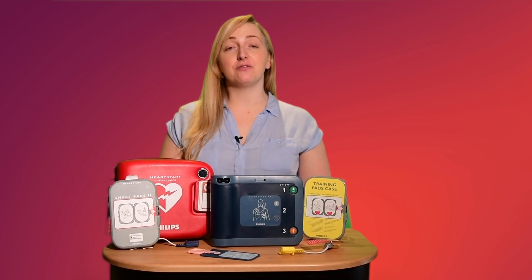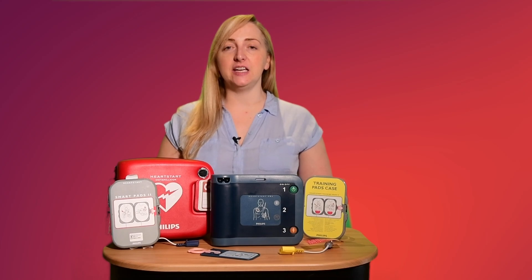Hi there, my name is Amanda and today we're going to look at the Philips Heartstart FRX AED.